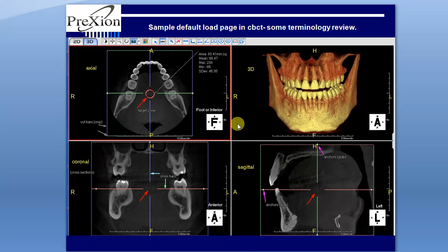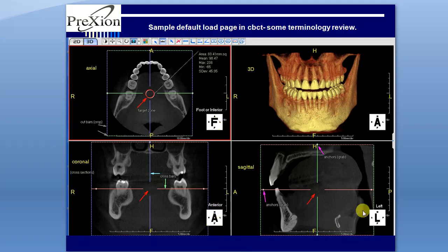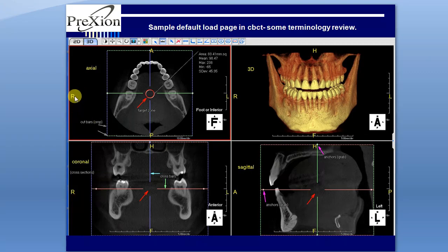Your orientation boxes: F for foot, A for anterior, L for left or could be right. And you are going to have R for right and L for left.